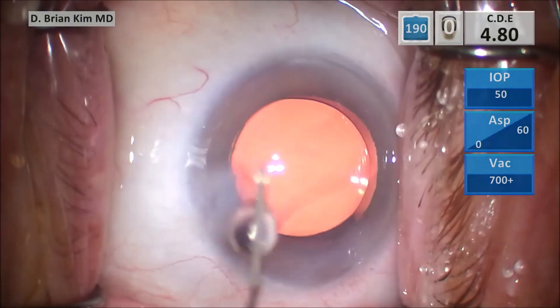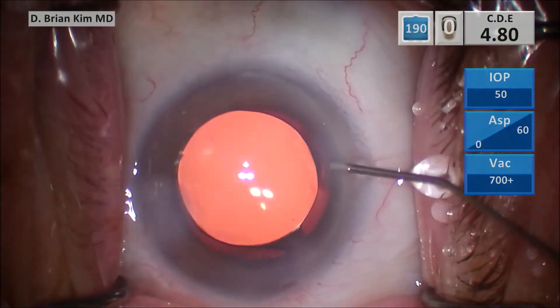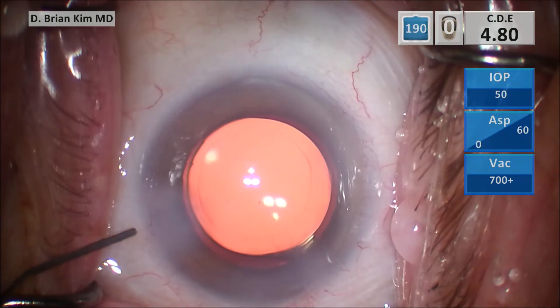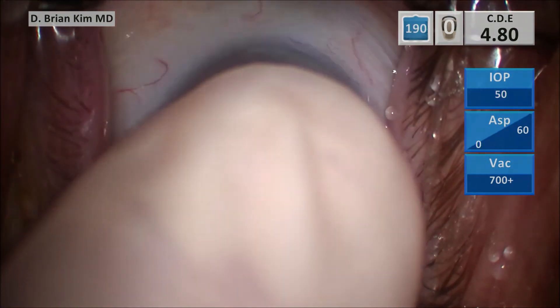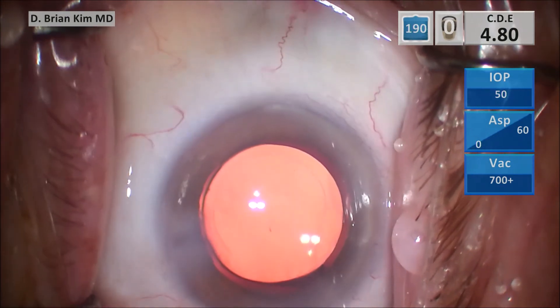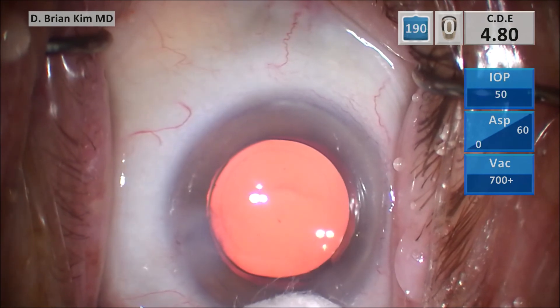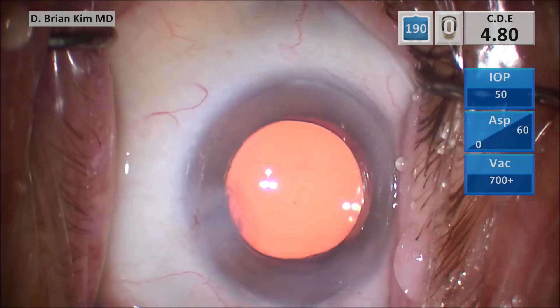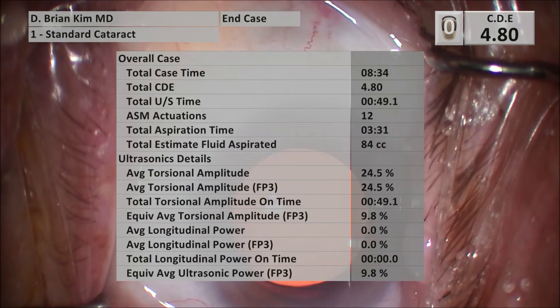With the deep set eye, some people might find it a challenge, but because I'm performing mechanical fracturing techniques, even if it's deep, it doesn't really interfere at all with my maneuvers. Double chop and cross chop do not depend upon having a deep set or a prominent globe. I'm able to disassemble the lens in any situation because the instruments are relatively vertical when I'm doing the chopping maneuvers, especially the double chop. The cross chop is so versatile because you can chop at any vector angle — using crushing forces to disassemble the lens. You saw this patient had a pretty dense lens, but the CDE was fairly reasonable, and this patient had a nice clear cornea postoperative day one and did well.